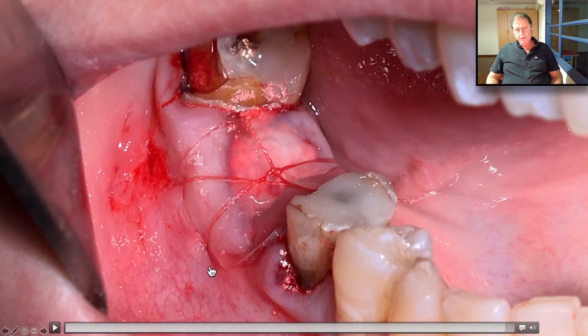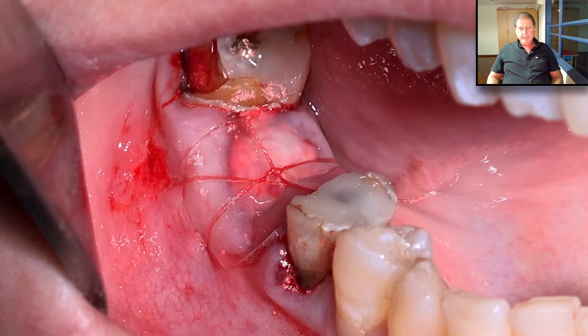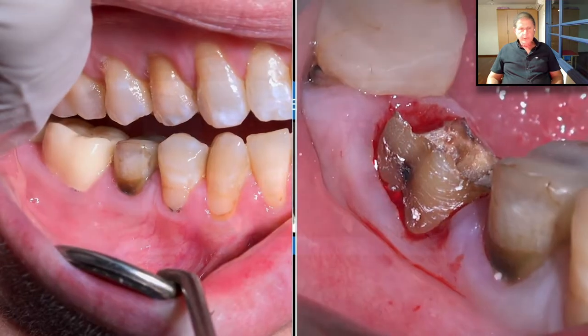So again, to repeat how we suture it: after placing the Oraid and sticking it to the mucosa, we go down into the mucosa from the mesial side to the distal side, then go mesially to the lingual aspect, from mesial to distal, come back mesially, and make our first knot. We don't need to suture through the Oraid like we did with the collagen sponge — we don't go with the needle through it. We just go above it and tighten it so the Oraid will not fall down.